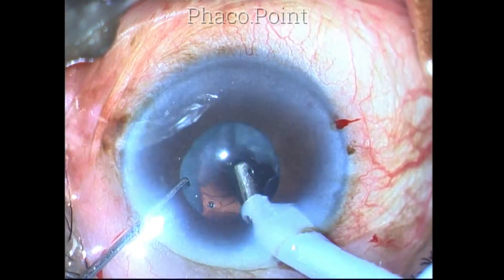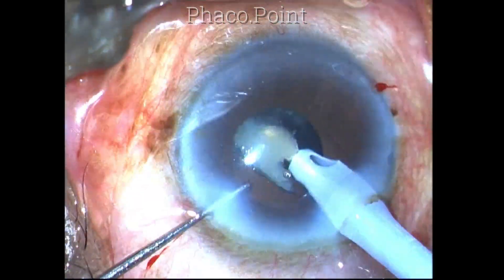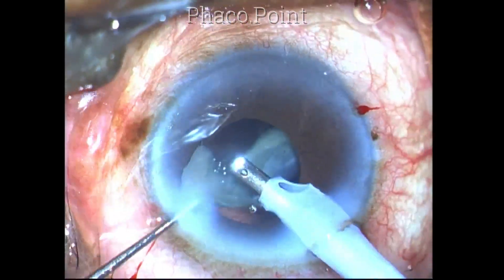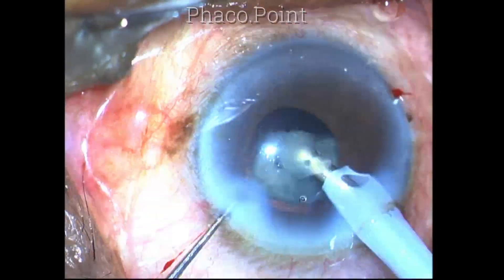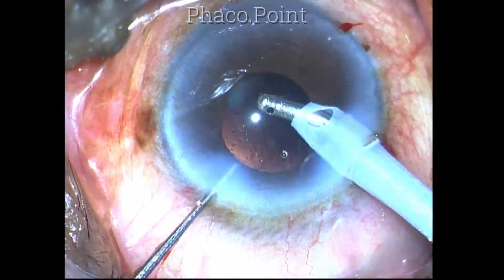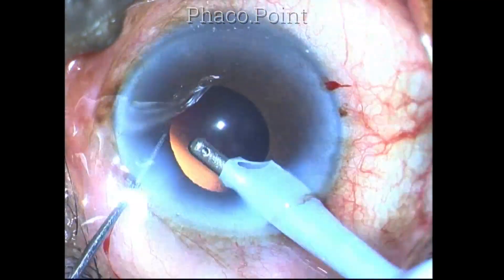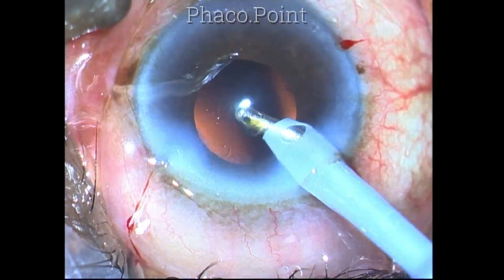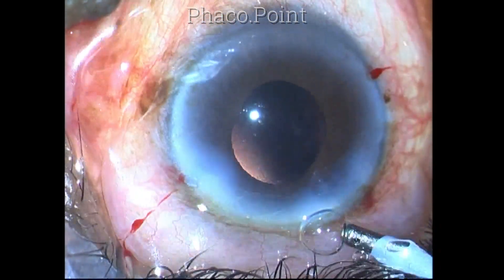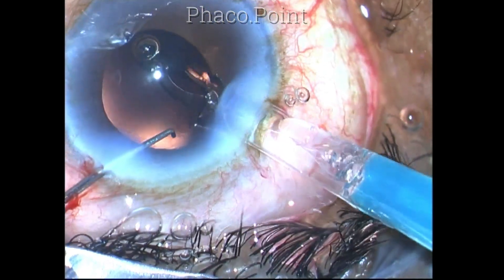Once the nucleus is emulsified, you see a thick inspissated cortex and epinucleus shell which is removed with the irrigation-aspiration probe. This can also be removed with the phaco probe, but given that the posterior capsule would be thin, I prefer the IA probe as it offers a greater level of safety. If a nucleus fragment is stuck to the phaco tip, all you have to do is hold your vacuum and simply pull it out — it will come. This saves time, though it works only if the fragment is small.